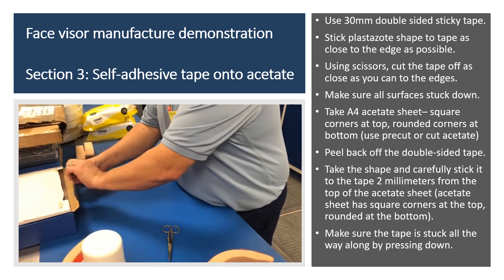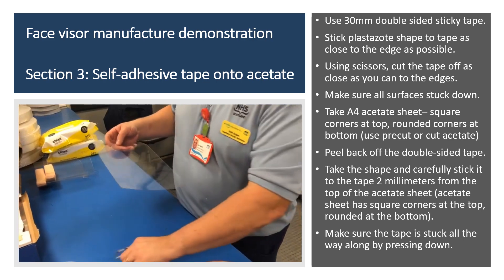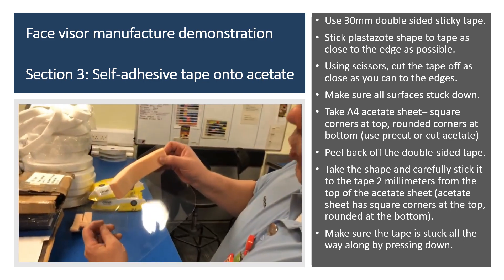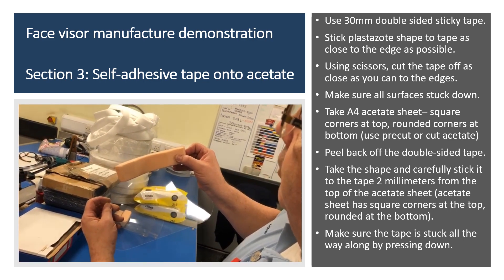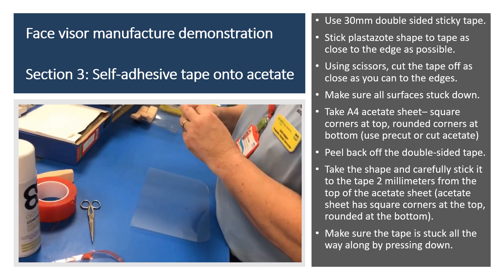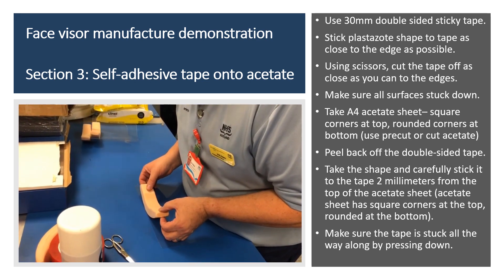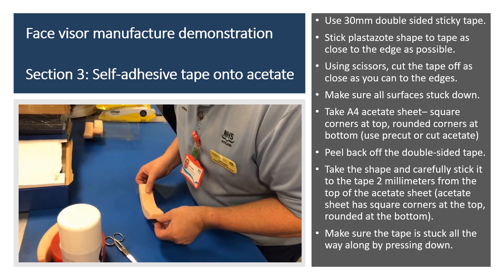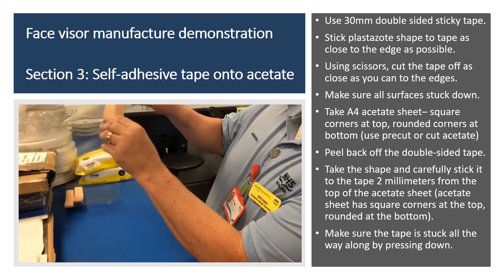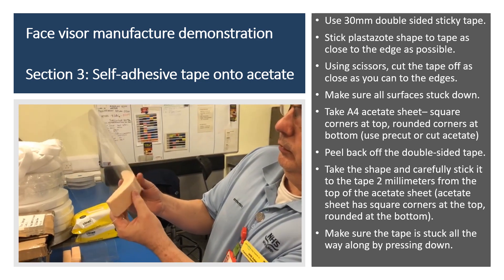Then take one of the acetates — these are the ones which are already pre-formed. What you want to do is judge this roughly in the middle. It's slightly better if you drop it down a little bit — don't have it bang on the edge, because if you go over the edge it'll leave a sticky residue from the tape. So just drop it down a wee bit on the acetate. You want the square edge at the top and the rounded edge at the bottom. Just look for the middle, stick it on, bring the sides up, and make sure it's secured all the way along. Give it a good press.